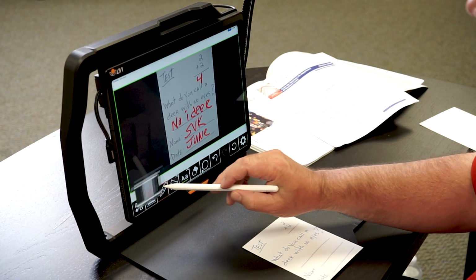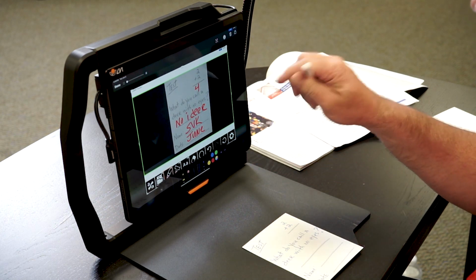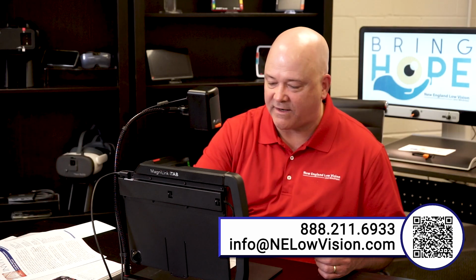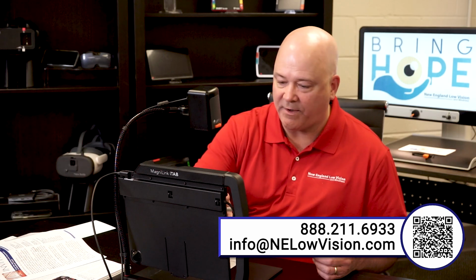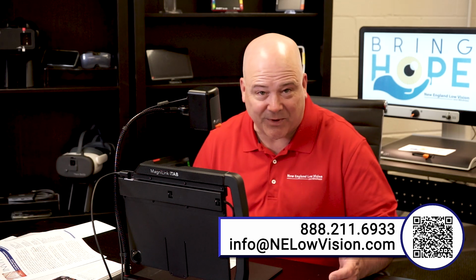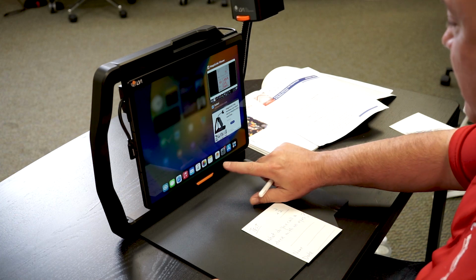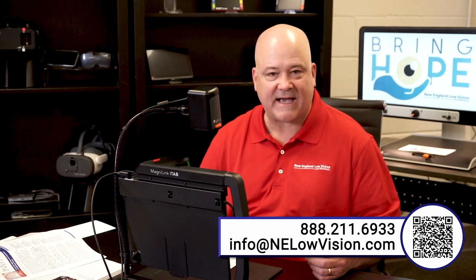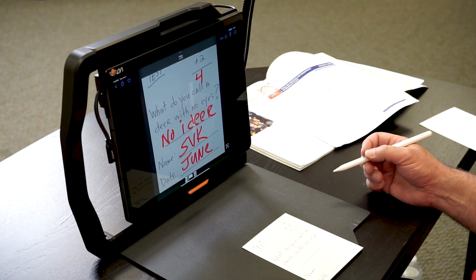When it's in the screenshot, of course, you can very quickly edit the document. So whether you want to change the edges of it, the left and the right, the top and the bottom. And so that's how we'll save it. We'll save it to the photos or save it to the files, wherever it is that you want to save it. And now when we want to go back to it, what we can do is just go to our photos, and there it is. There's our test.